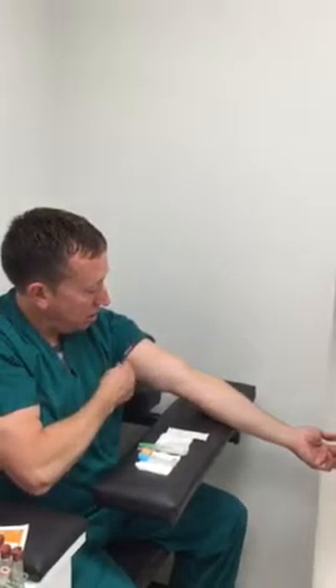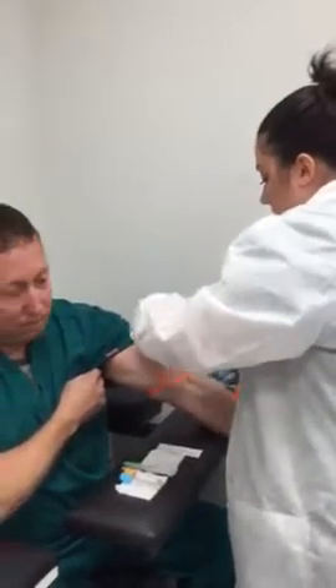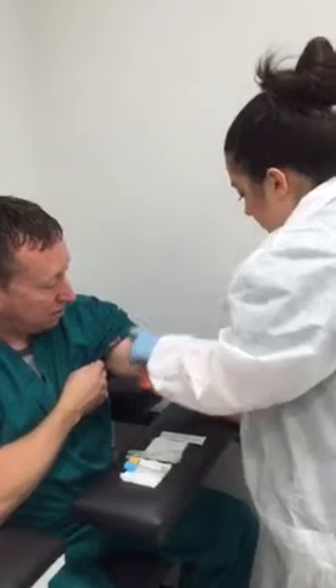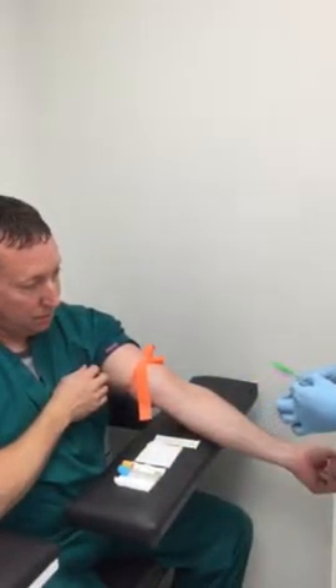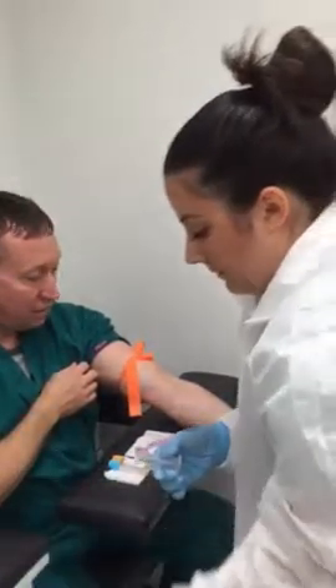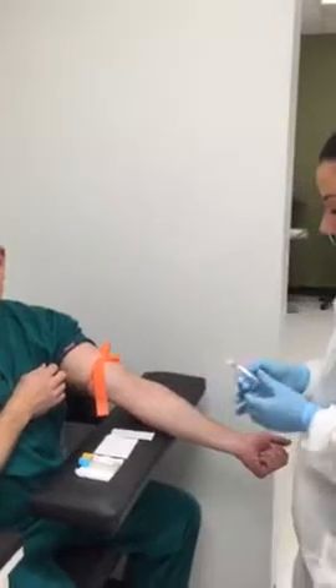Now that she has all her equipment ready, the phlebotomy student is going to go ahead and reapply the tourniquet. She's going to position the arm, remove the safety cap, and when she inserts it, it'll be beveled up.